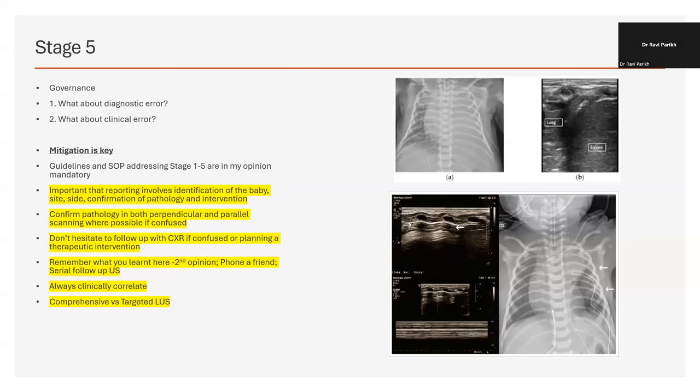I had a question from Satish. Satish, go for it. Yeah, thanks, Alok. It's regarding the M mode. I know it's good practice to do the M mode, but is it absolutely mandatory and do you still do it in all the zones in every scan you do?